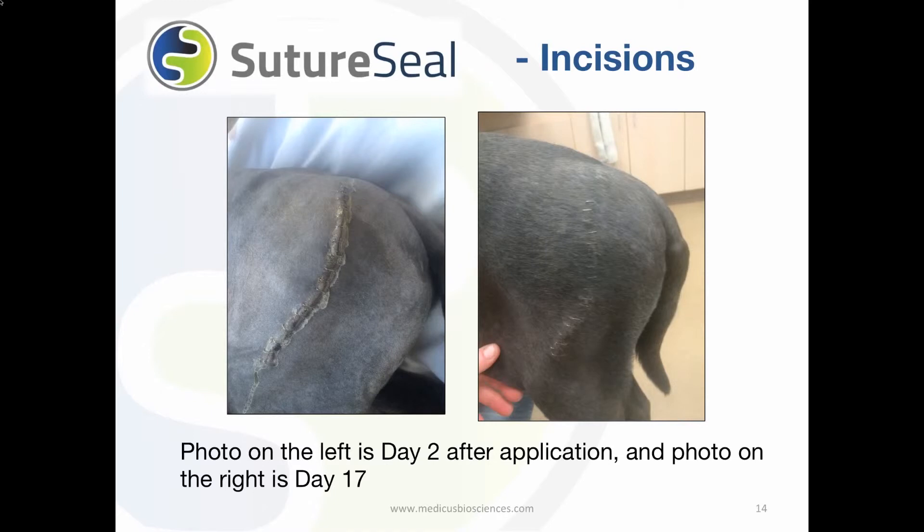SutureSeal is often used on orthopedic surgery incisions. The photo shows what SutureSeal looks like on the incision 2 days after application. Approximately 3 weeks later, you can see the incision healed nicely.